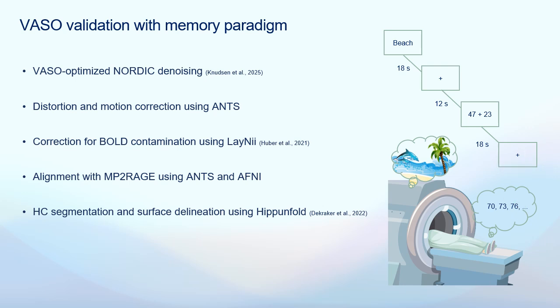VASO-optimized NORDIC denoising was applied to the data. Distortion and motion correction were conducted using ANTs. The VASO data were further corrected for BOLD contamination using LAYNII.